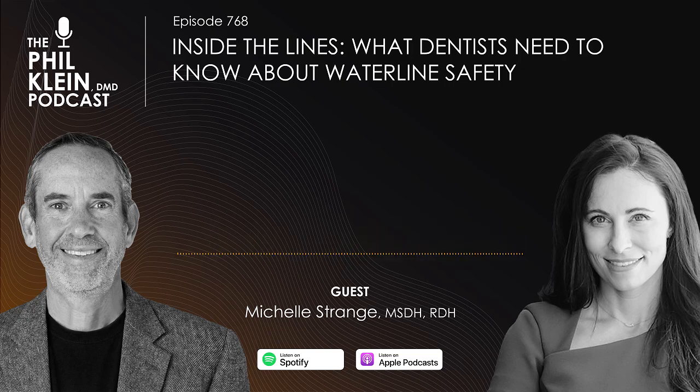Yeah. And Michelle, one last thing. What about pulpotomies? What kind of water should our dental clinicians be using for pulpotomies? That is sterile water all day, every day. And the CDC has very clear guidance on what constitutes a sterile procedure or a surgical procedure where we should be using sterile saline or sterile water through its own delivery system.